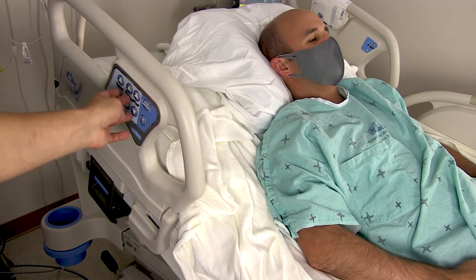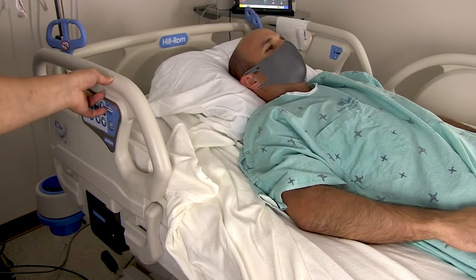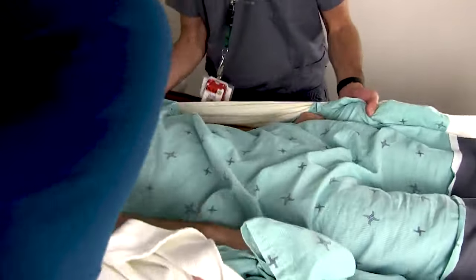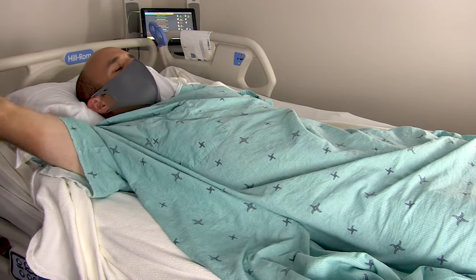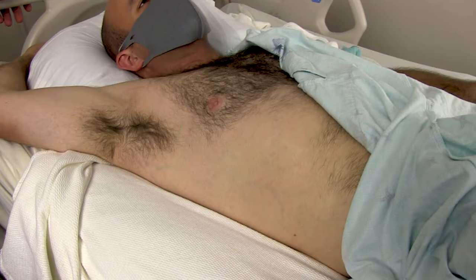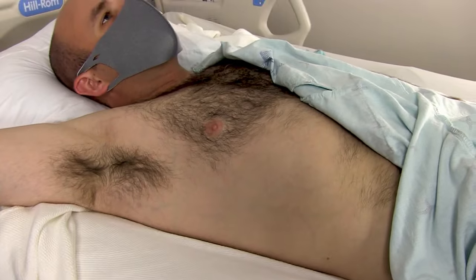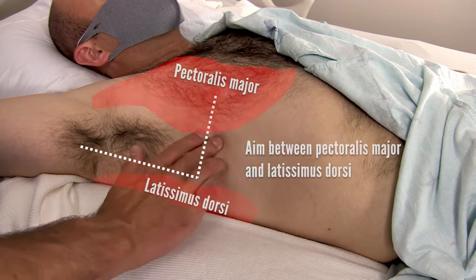For any procedure, always consider patient positioning before you start. Lower the head of the bed until it is flat and raise the entire bed to a level comfortable for you to work at. Slide the patient over to the edge of the bed you'll be working on, and have an assistant stand cephalad to you on the working side to hold that arm up and out of the way. Alternatively, you could put a restraint on that arm and hook it up to the bed if you don't have an assistant. Get the patient's gown out of the way and take this time to really examine your procedural site.